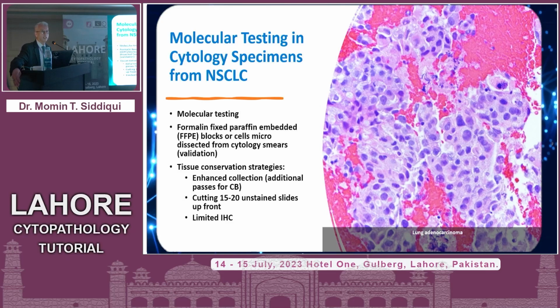Obviously, you can't really predict the outcome of cell block collection, but if you optimize the specimen in such a way that limited amounts are extruded out for smear preparation and the majority of the specimen is relegated to the formalin container using a clot method, that will yield good examples such as this with frankly outright malignant cells. So what we do over here, this is where tissue conservation is really necessary.